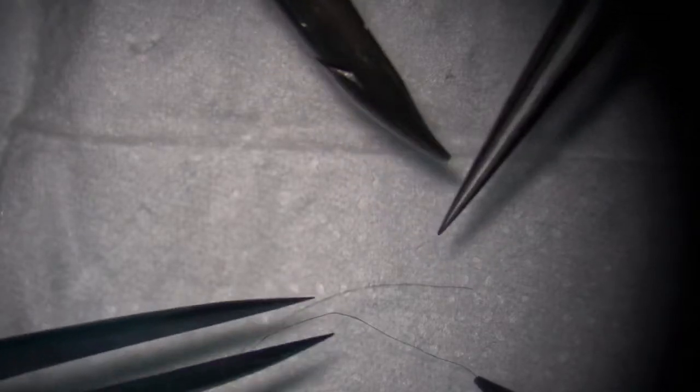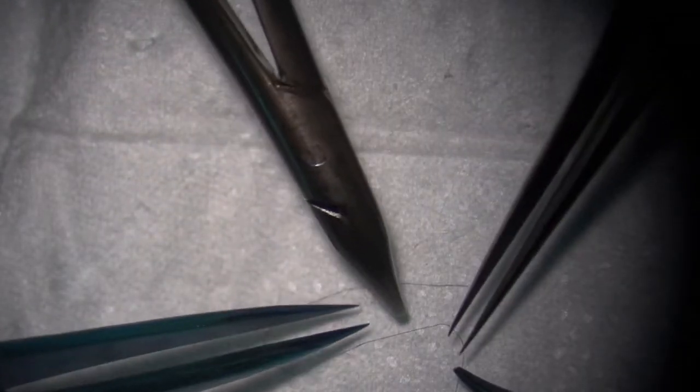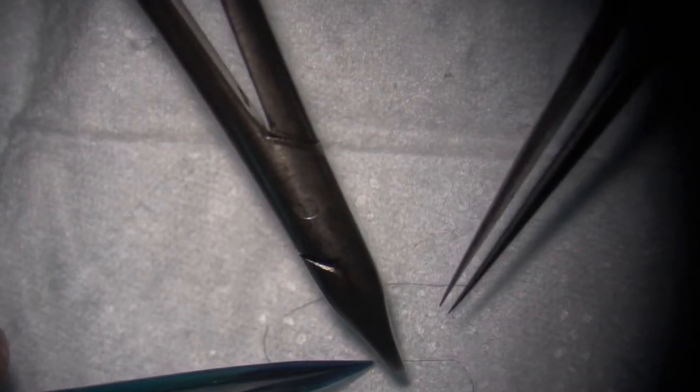Oh, because I've got to pull this way. Yeah. Okay. Bring it to here. Let me, a little too much. Oh, here, another thing I forgot. A number, 2/3. Oh no, 2.5 or 3 times. Holding the suture. Yeah. 2.5 to 3 times of the short end.